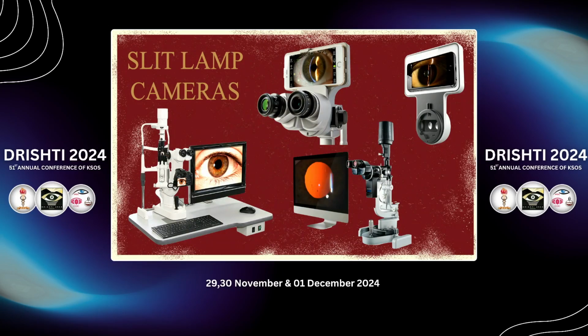Okay, I'll just give a few quick points. If you want to take an anterior segment photograph with a slit lamp, you just take your phone, and a very important tip: nowadays all these phones have 4-5 cameras in the back. Earlier it was just one camera, very simple. Now with 4-5 cameras, when you start trying to align the camera to the eyepiece, it switches to the other camera. So what you do is install an app called Open Camera. Once you install Open Camera, the camera doesn't switch from one to the other very quickly. Then I'll tell you how you can quickly align with the slit lamp.